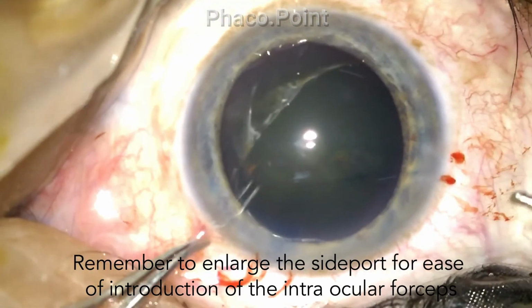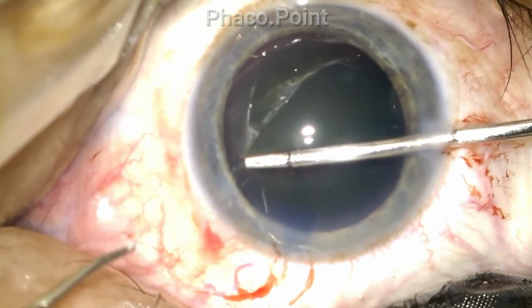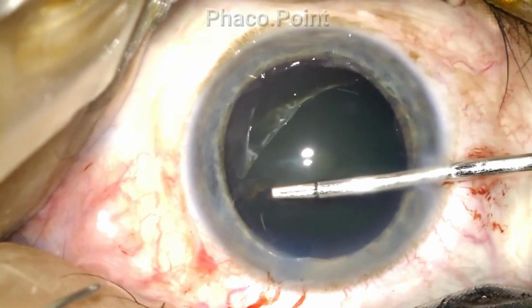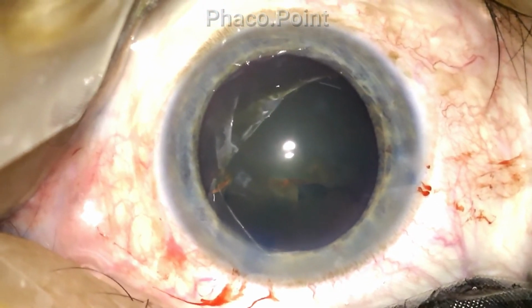Whilst stabilizing the globe, the intraocular forceps is now introduced again from the right side and holds on to the flap raised by the capsulotome, and now an attempt is made to start the capsulorrhexis. As you can see, I have initiated the capsulorrhexis at this stage.